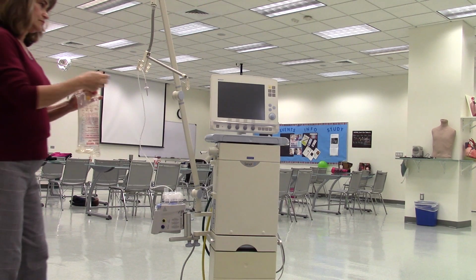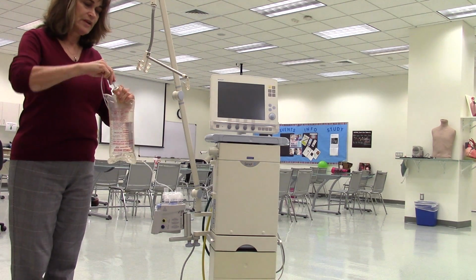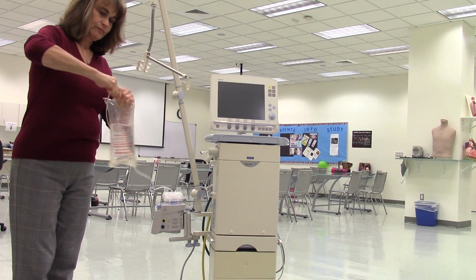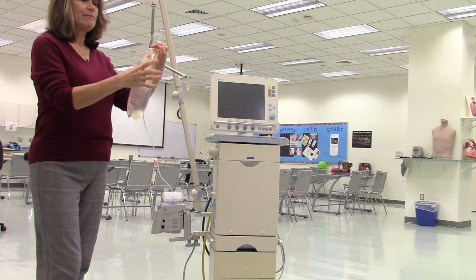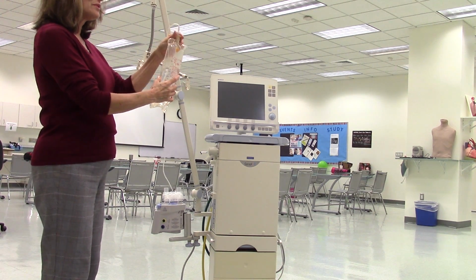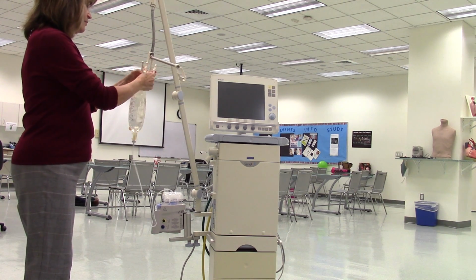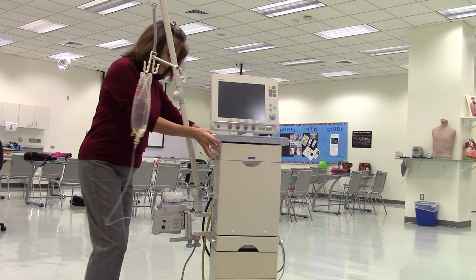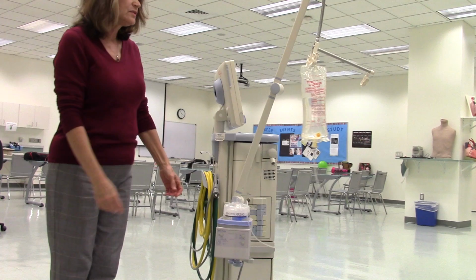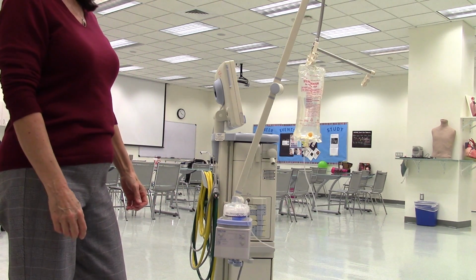And this is, you said sterile water? Yes. Sterile water for inhalation. So I just pierce the bag until the little sharp object goes through into the bag. Okay. Turn it upside up. And then it'll start filling the chamber. So go ahead and read. Oh, perfect. It says, connect the tubing to a bag of H2O labeled as sterile.